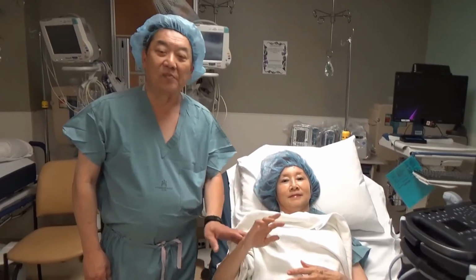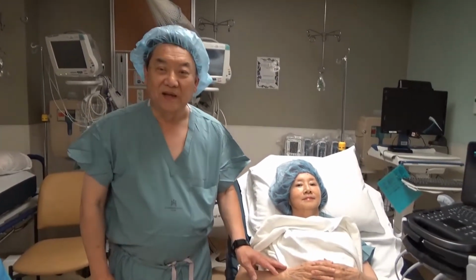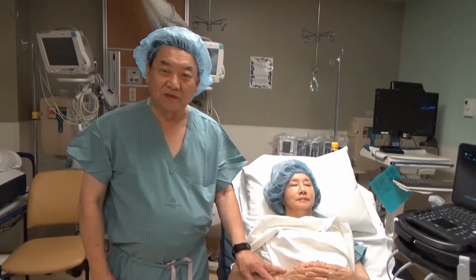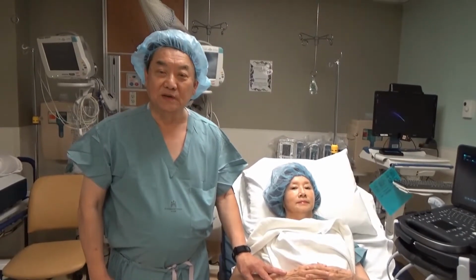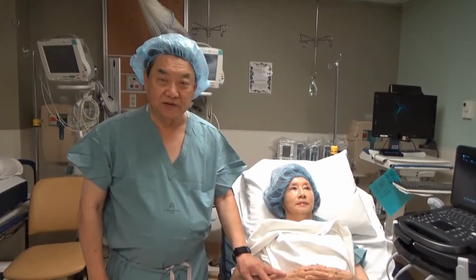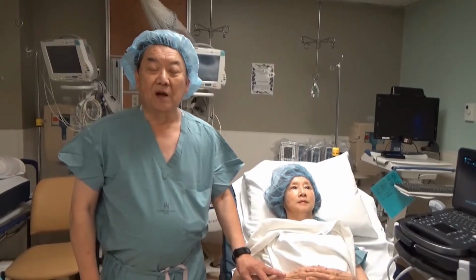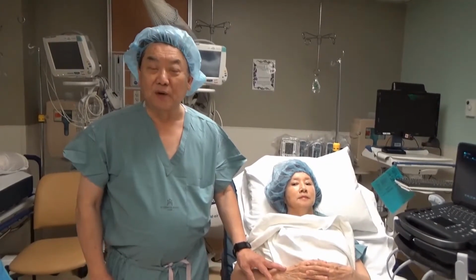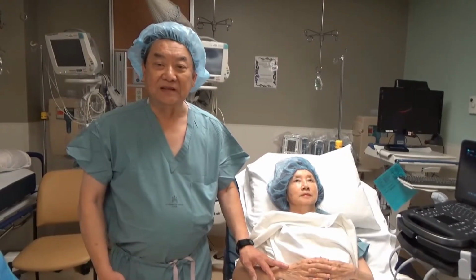Okay, great. So Linda has requested that I do not poke her, inject her, or do any invasive procedure, and I certainly do not want to hurt her. So today we're only going to simulate the procedures. And for the purpose of this demonstration, we will not use sterile technique. Obviously, in your own practice, you use sterile technique, but for our purposes, it'd be much easier if we just demonstrate the technique.